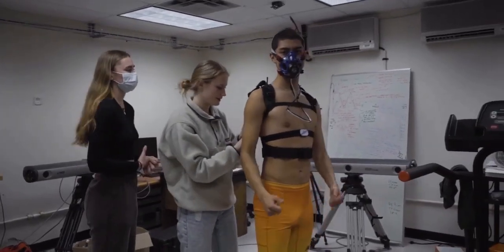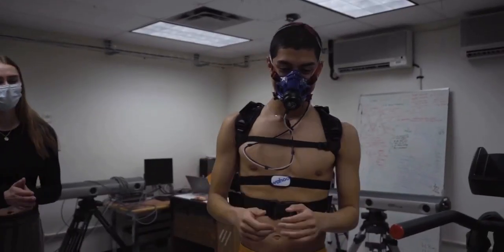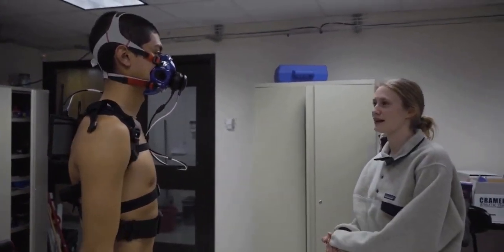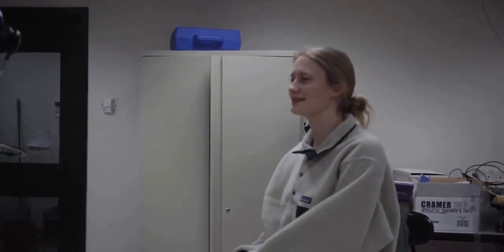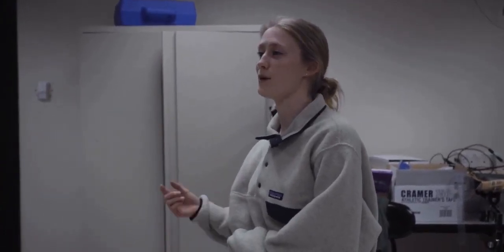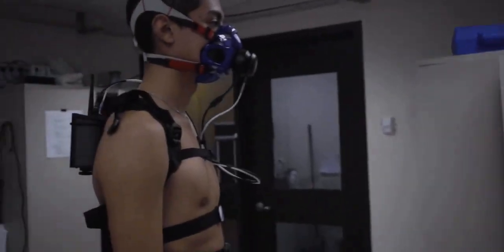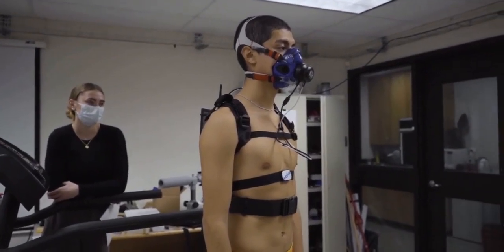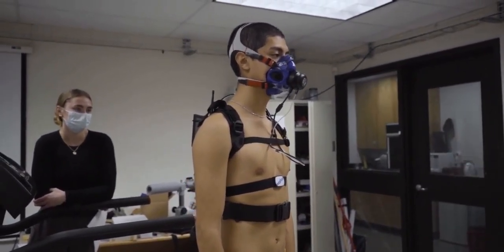So basically for our protocol, we're gonna start with three minutes at your warm-up pace — so eight miles an hour. After that, we move up to 8.5 miles an hour and stay there for another three minutes. Then every minute we go up by 0.5 miles an hour. When you start to near your VO2 max and get more tired, we'll ask if you want to go up by 0.5 miles an hour or 1% incline. Speed is thumbs up, incline is like this.